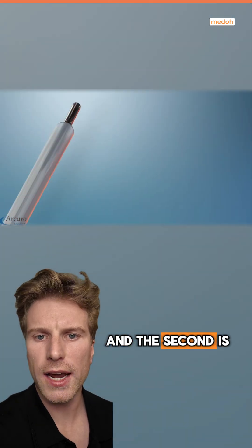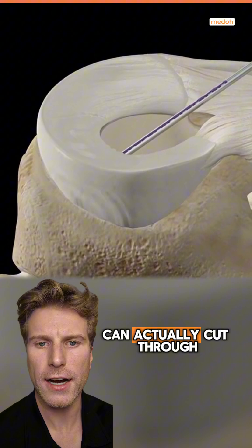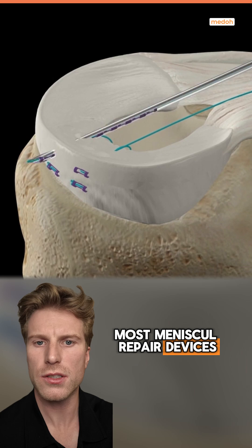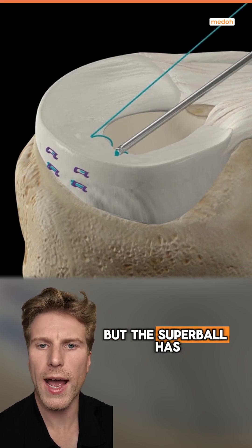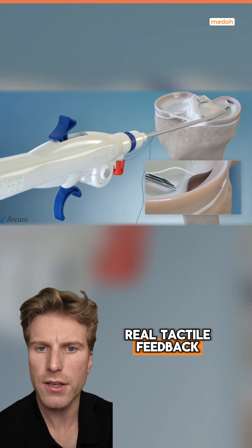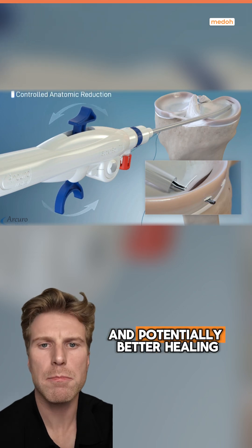The first problem is manual tensioning. Tensioning is critical — too much can actually cut through the meniscus and the tissue, while too little might prevent healing. Most meniscal repair devices rely on pulling the suture from outside of the joint, but the Superball has an in-joint tensioning mechanism. This gives the surgeon real tactile feedback and allows gradual tensioning or loosening for more precise control and potentially better healing and outcomes.